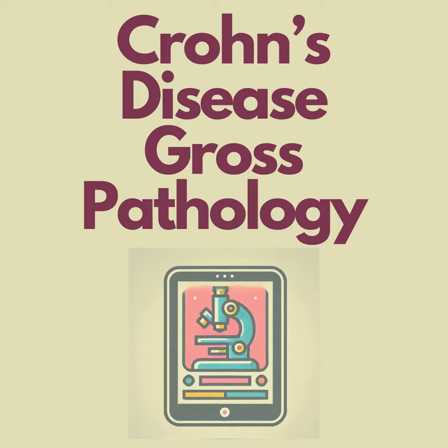Okay, what about that stricture we saw in gross examination? Are we going to be able to see that under the microscope? Yes, definitely. We can look at the stricture microscopically to see what's causing it. So is it just inflammation and edema, or is there a lot of fibrosis? Fibrosis, that's the thickening and scarring of the tissue. Exactly. And that can make the stricture more difficult to treat. So we're looking at the stricture to see how much fibrosis there is.